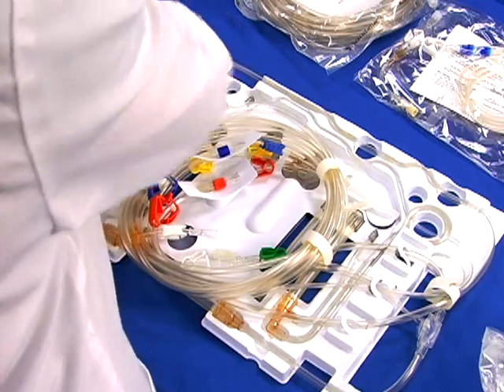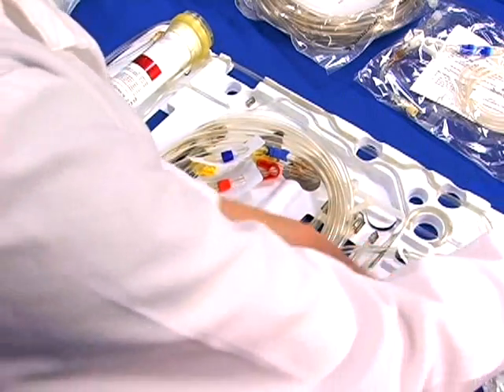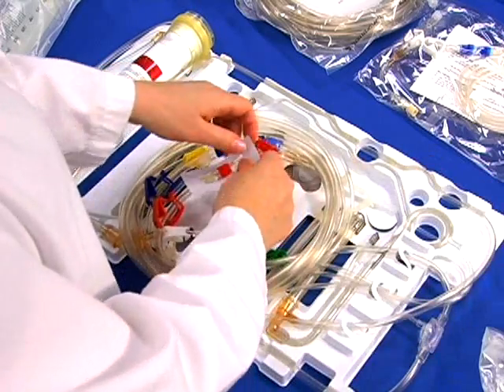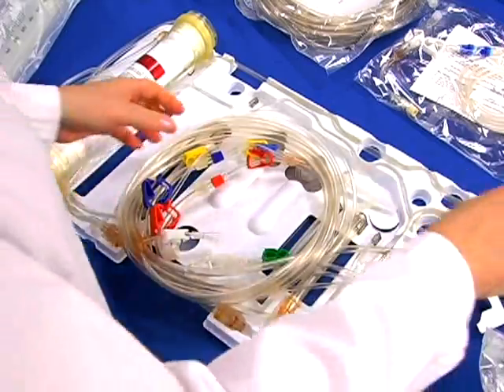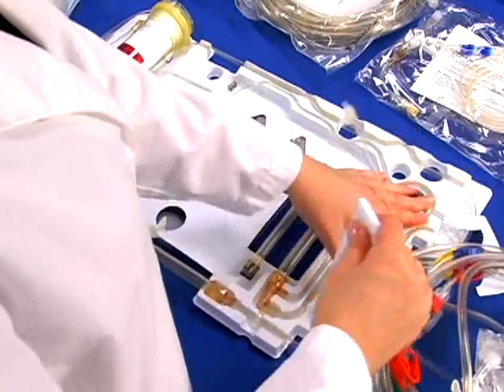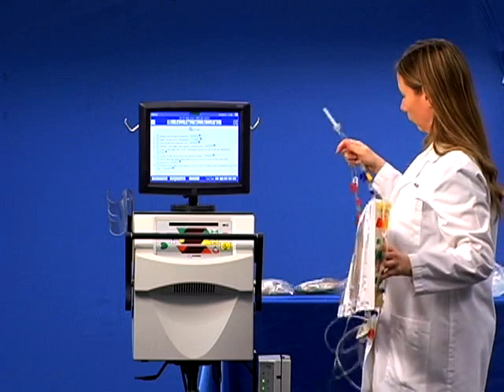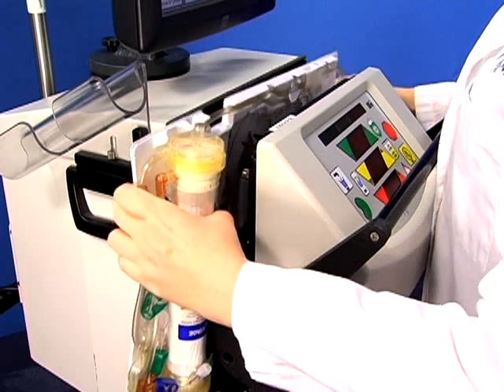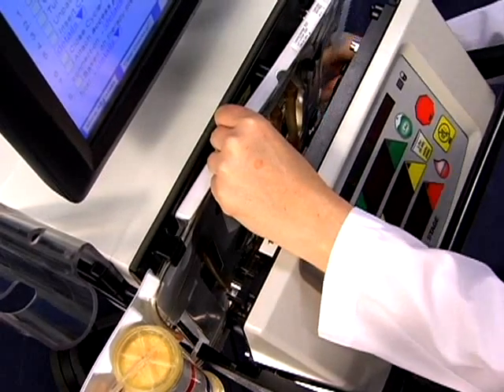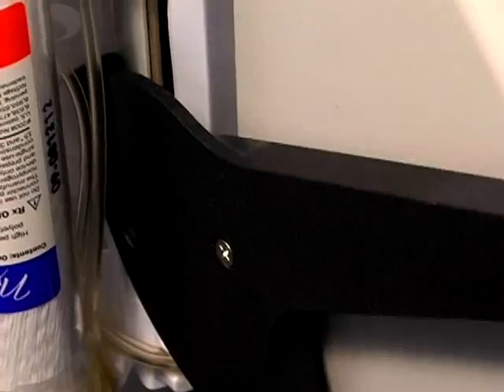Unpack the cartridge and tighten the patient line connections. Lift the priming spike from the cartridge and insert the cartridge into the cycler, and press the tubing into all three air detectors. Close the cycler door carefully to ensure tubing is clear.